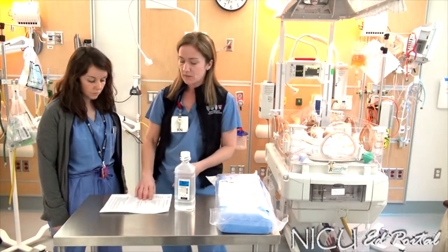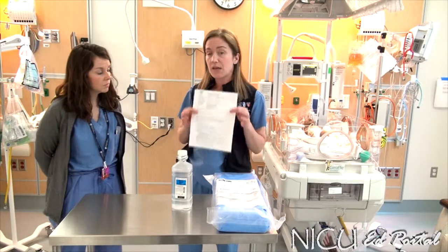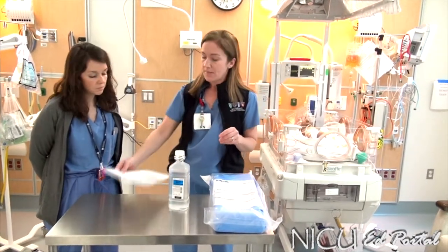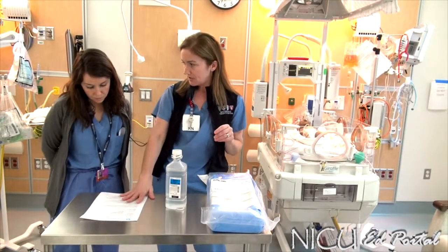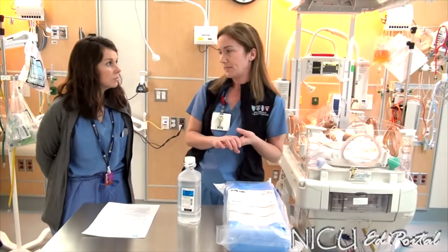First and foremost, any time that you have an infant that's going to need either a thoracentesis or a chest tube set up, you would refer to our nursing policy, NICU C8. In here it has your policy and procedures that you would need to follow, and it also has the steps on how to set this system up.